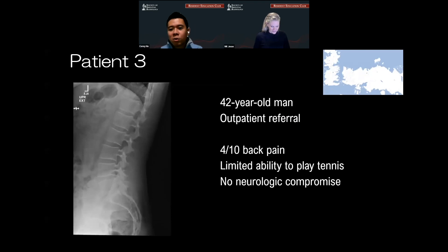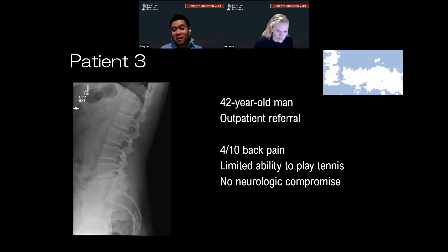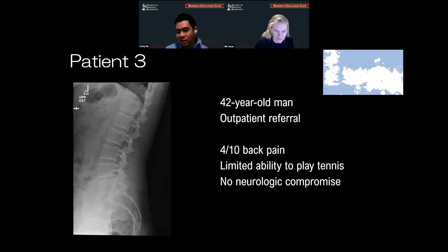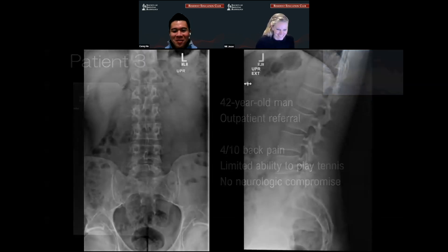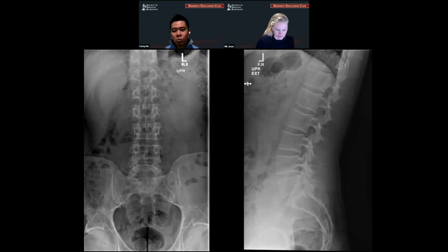Patient three is a 42-year-old man outpatient referral, 4 out of 10 back pain, limited ability to play tennis without neurologic compromise. This was referred to us and further research found that the patient had actually majored in tennis in college — he was not actually part of the ATP tour. These are your plain films. There's really not that much degeneration on this patient — obviously the patient's an active tennis player and just trying to find other causes. The plain films are read as basically normal.